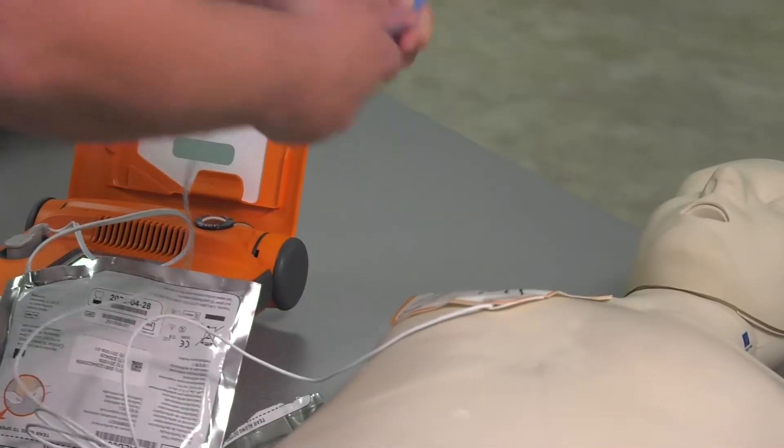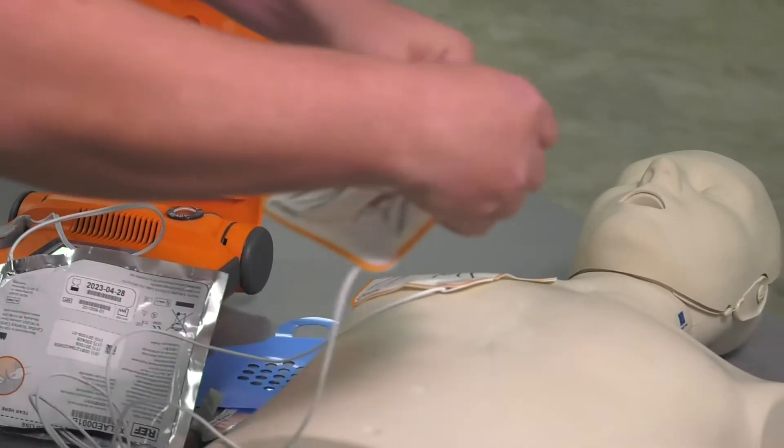Firmly place the pad without the blue plastic on the patient's bare chest, exactly as shown on the pads.